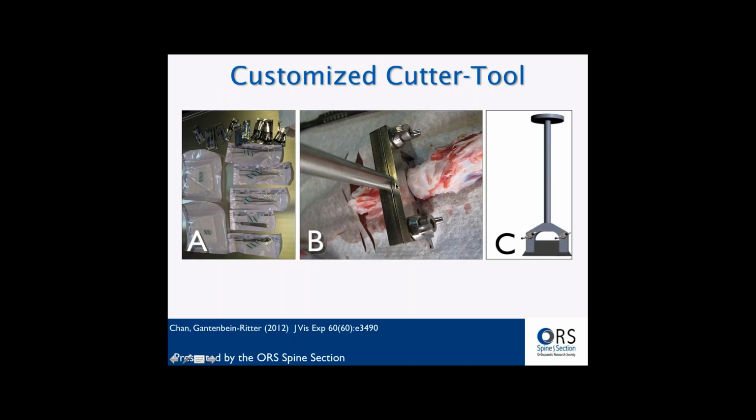And for this, we developed, as shown here in the middle picture, a way to cut these tails. We published a movie showing all these tools, and this is a picture of this very easy and customized cutter tool.